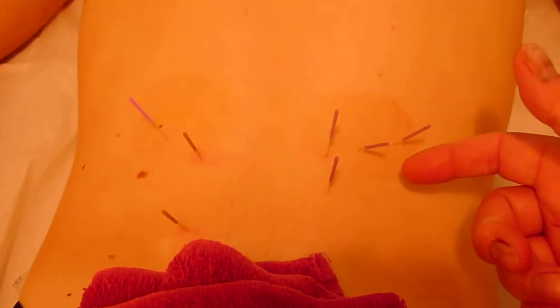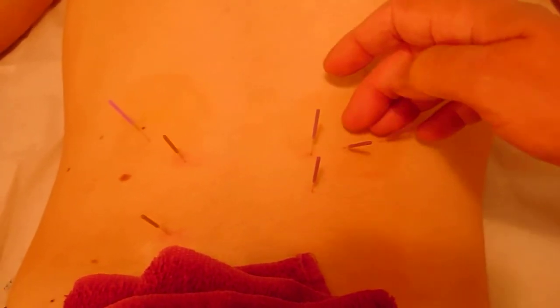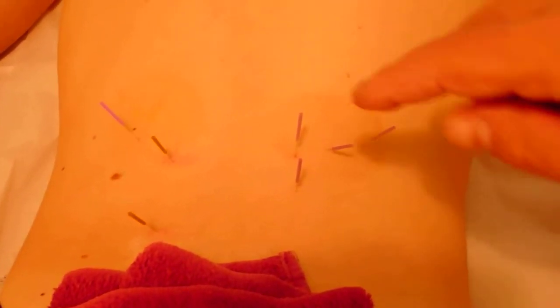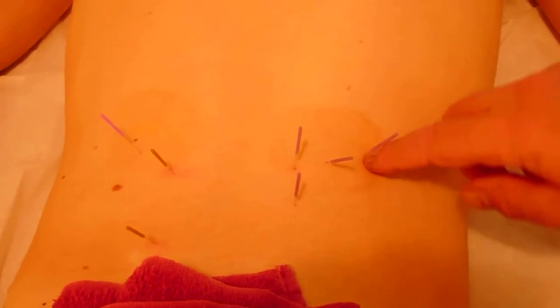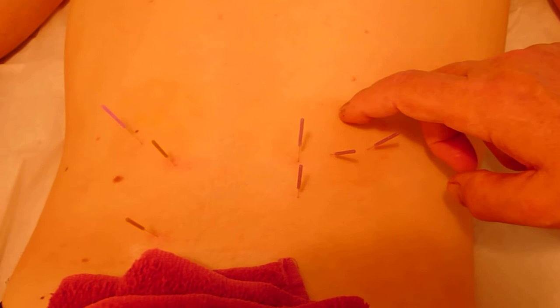There I've done the motor point of the quadratus lumborum on the right and on the left, and then some of the paraspinal muscles. You'll notice there are cupping marks from last week — I did cupping because he was so tight and it left marks. Now what you'll notice here on the right is how pink the skin is, and that's a histamine response you often get when the muscle's quite tight.